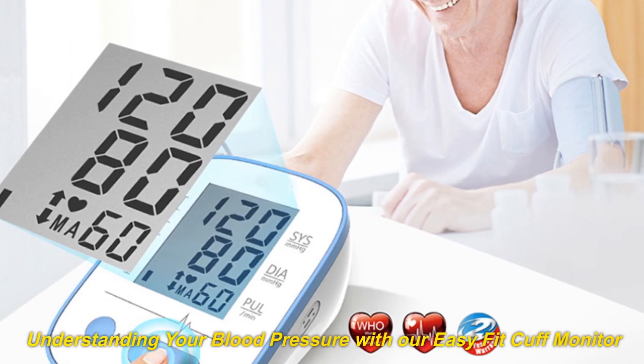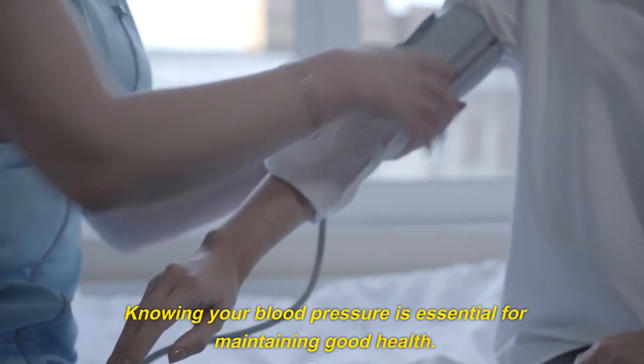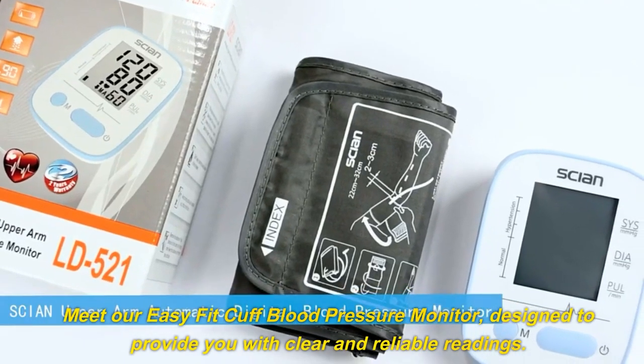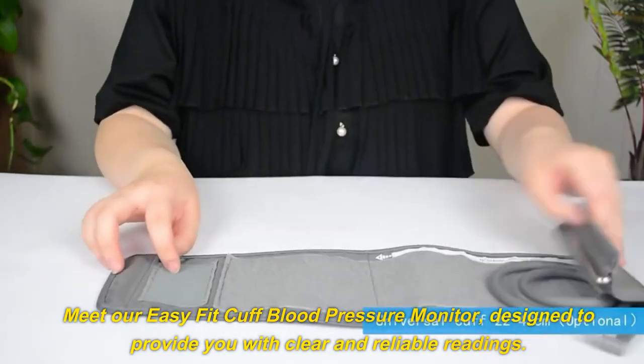Understanding your blood pressure with our Easy Fit Cuff Monitor. Knowing your blood pressure is essential for maintaining good health. Meet our Easy Fit Cuff Blood Pressure Monitor, designed to provide you with clear and reliable readings.